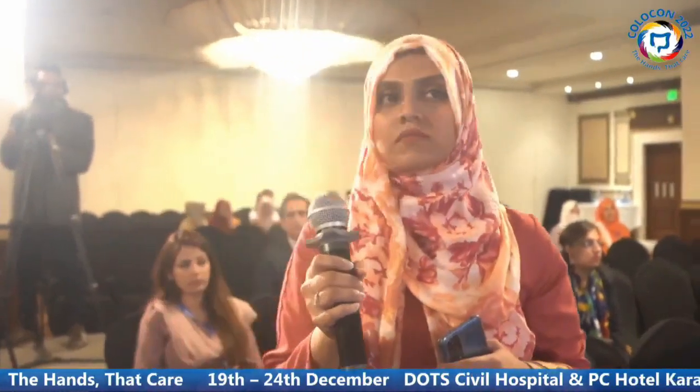Right. May I add something? So just coming back to what Raza has just said, I think there is nothing that's going to make our life easy. If you're looking for an easier option of where fibrosis, where tumor is, nothing would help. In our practice, generally, endoanal ultrasound is reserved to complement MRI.